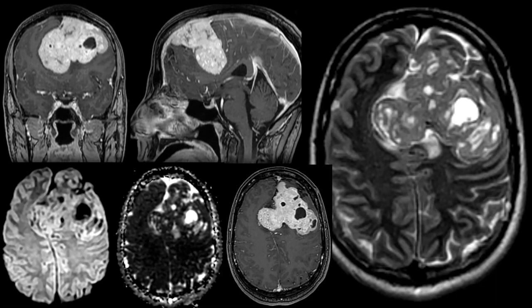Okay, I can do it. You got T1's post at the top. You've got a T2 on the right. Then at the bottom, there's a diffusion ADC and then an axial post contrast. You've got an enhancing mass with some areas in the middle that are a little heterogeneous. They're either cystic or necrotic. It does look like an extraaxial mass. It does look like that it is involving the dura.